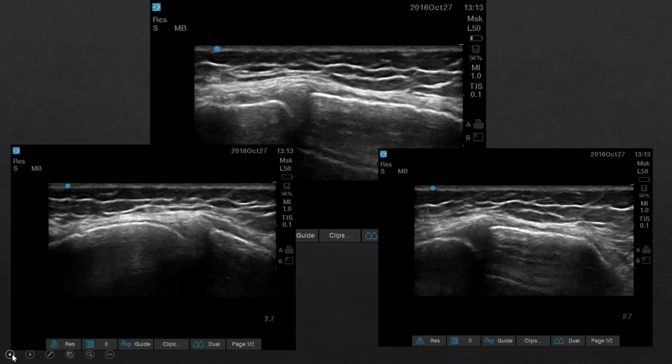And every patient is different. Right now we're talking about normal scans, expecting a normal anatomy, trying to get the probe placement correct, patient position, and to understand how normal structure look like. Abnormal can sometimes throw you off, and sometimes you may have to change the position and limb position, probe position to see the structures better.